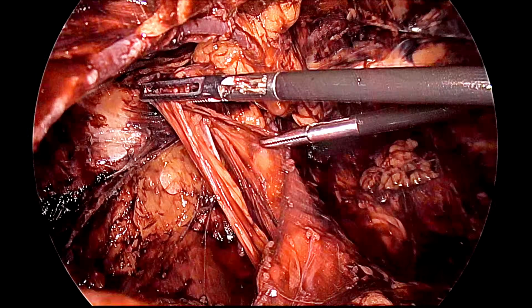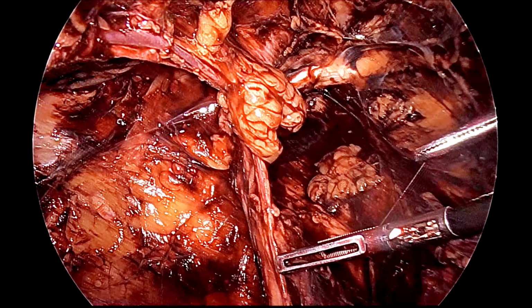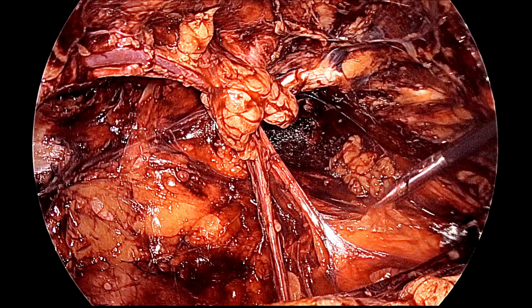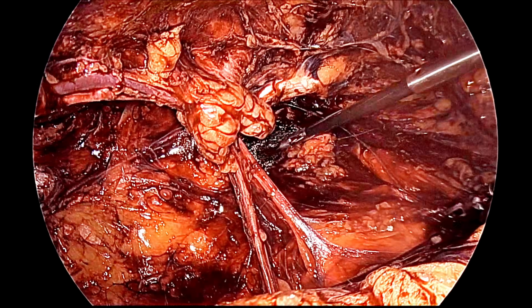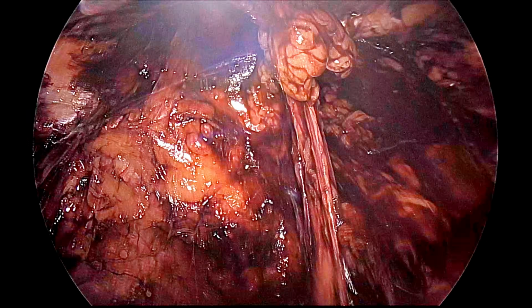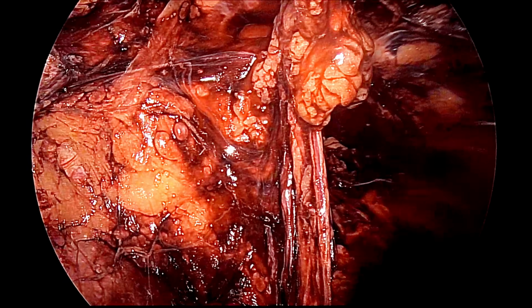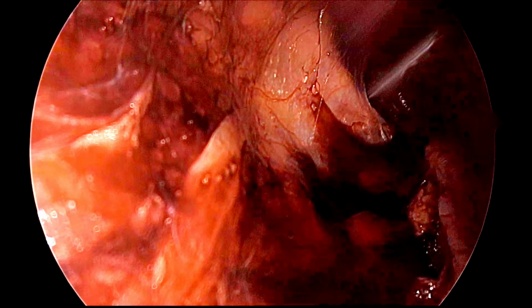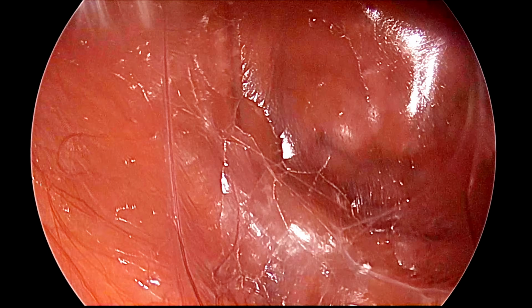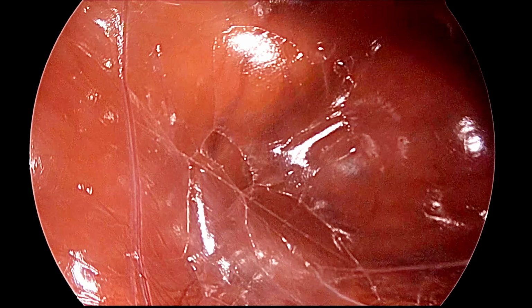You can see the vas and spermatic vessel are clearly visible, and the entire sac is completely separated. You can also see the space of Retzius. This is the vas medially and laterally the spermatic vessel, and this is the space of Retzius. Above is the Cooper ligament, here is the inferior epigastric vessel. So, you can see all the triangle of doom, and this is the remaining defect, not the sac, because once the sac is taken out, then you can enter the telescope inside the defect and you can examine.